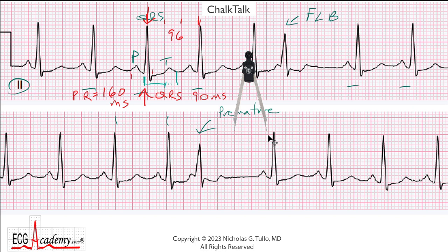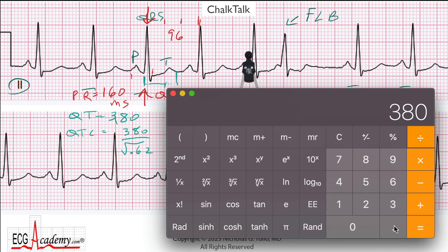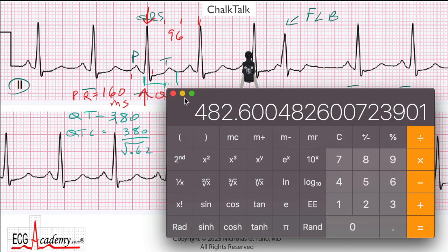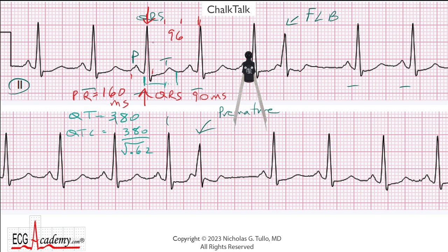So if we say the QT interval is 380 milliseconds, then the QTc would be 380 divided by the square root of the R-to-R, which we already said was 620 — so that's 0.62. We'll calculate 380 divided by the square root of 0.62, and that gives us 482 milliseconds, which is a little bit long. It actually does look a little bit long because the T wave should not really go past the midpoint between the two R-to-R intervals. You can see the T wave actually extends past that midpoint, so indeed a QTc of 482 milliseconds appears to be accurate.